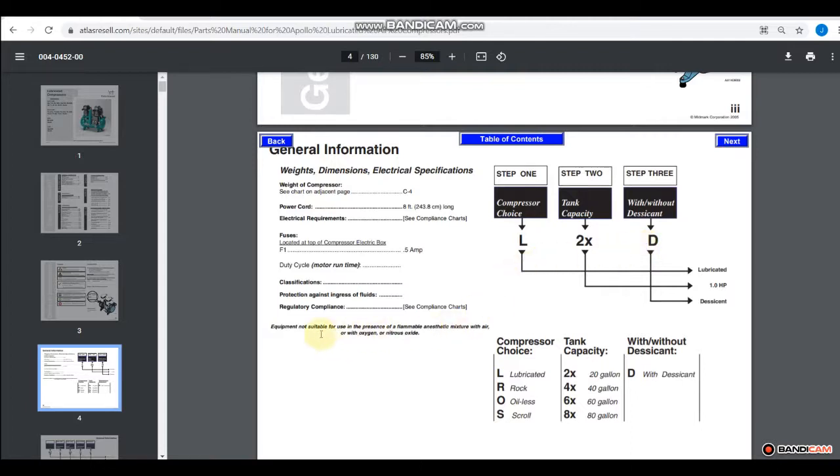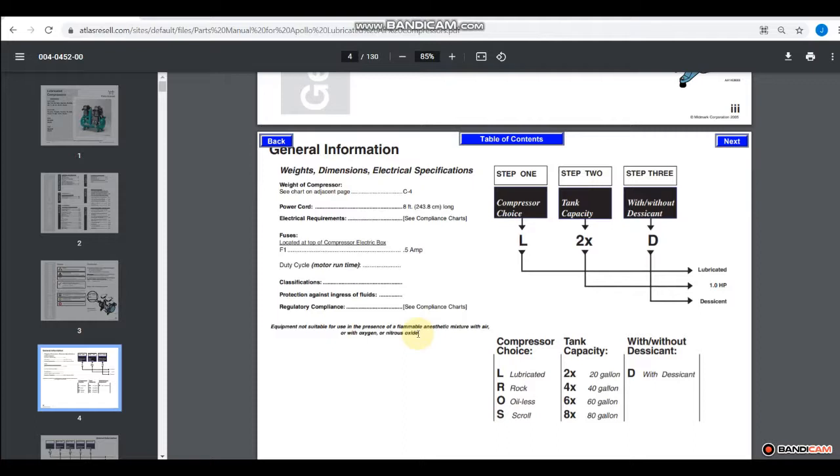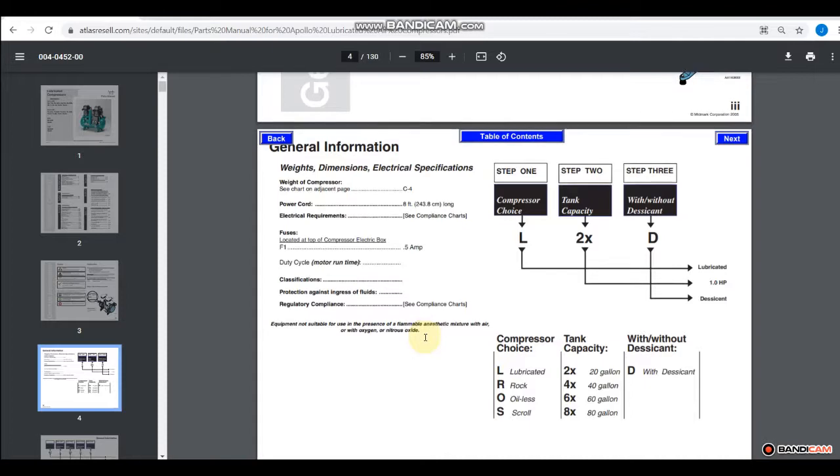And down here, it basically says equipment's not suitable for use in the presence of a flammable anesthetic mixture with air, oxygen, or nitrous oxide. And the reason that is is because that air compressor is compressing ambient air, and there can be an explosion if you pull in flammable or combustible gas into that compressor head when it's hot.